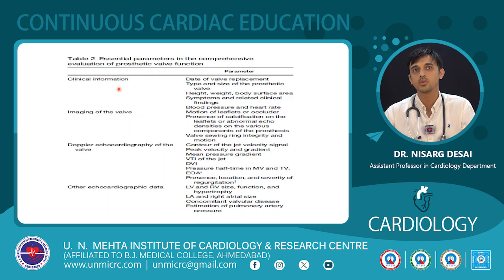So coming to the topic, the assessment always begins with the clinical information, followed by the imaging modalities, whether the screening echo is showing any abnormality. After that we can go ahead with the Doppler evaluation, and lastly the supportive findings on echo, as well as sometimes we can use CT and cine fluoroscopy as well to further evaluate the prosthetic heart valves. So each one of them has got an importance.